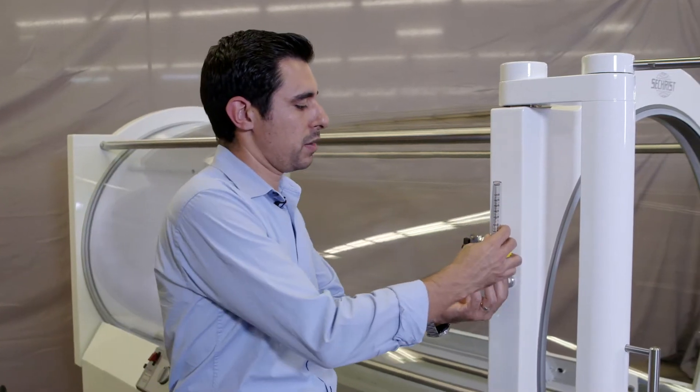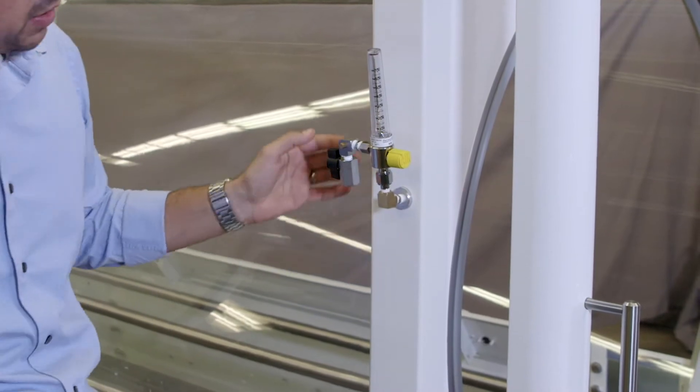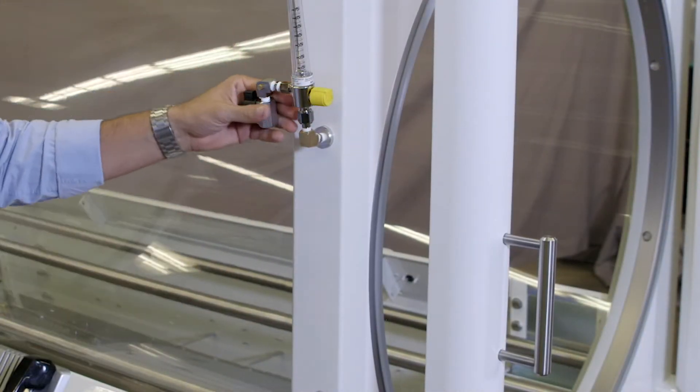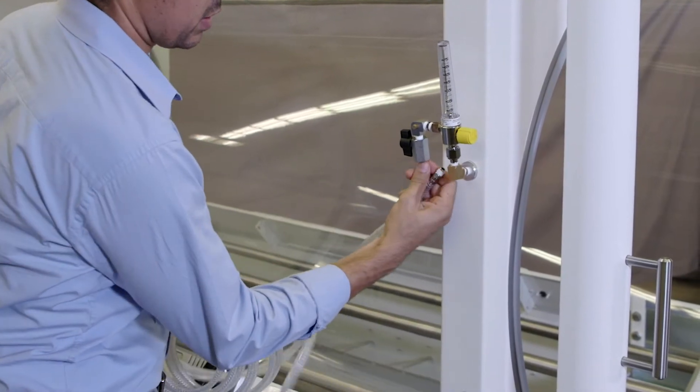Install the flow meter using the DISS nut fitting and fasten using a crescent wrench. Ensure you align the flow meter with the side of the chamber. Next, insert your air supply hose into the valve and install using the same crescent wrench.